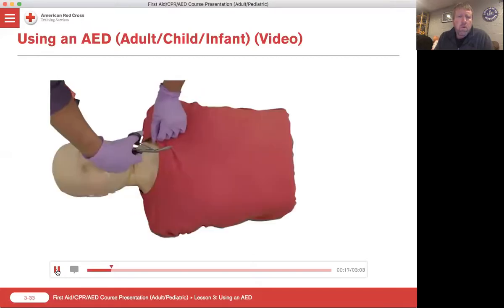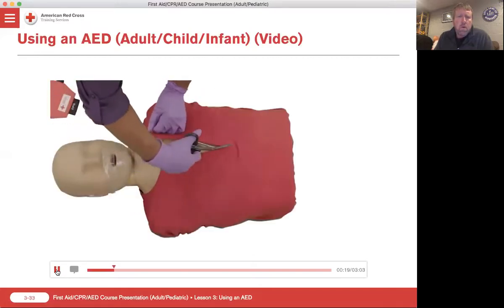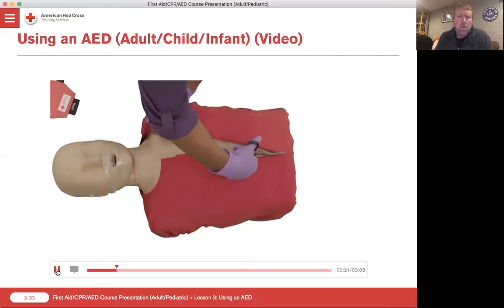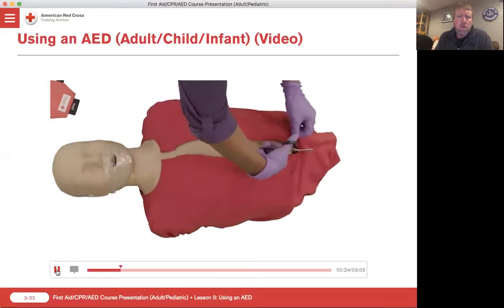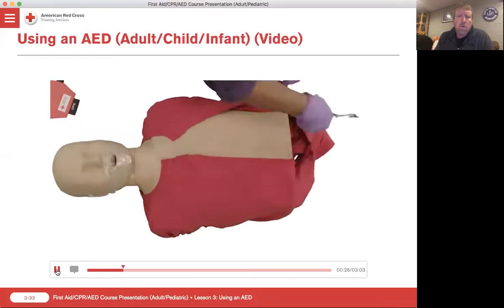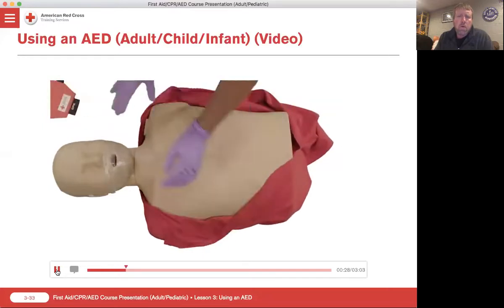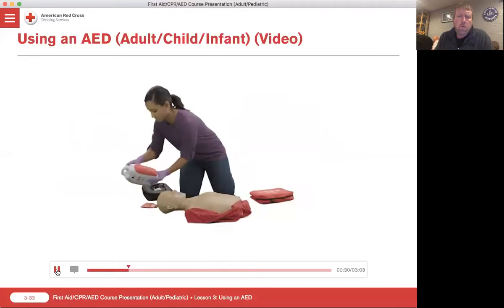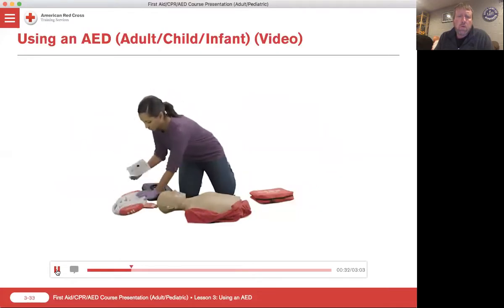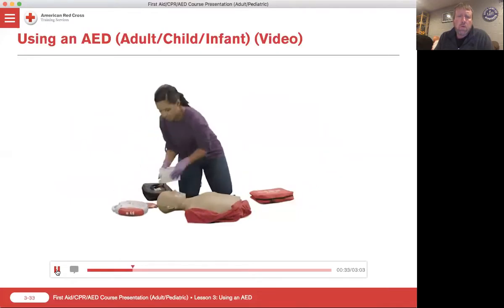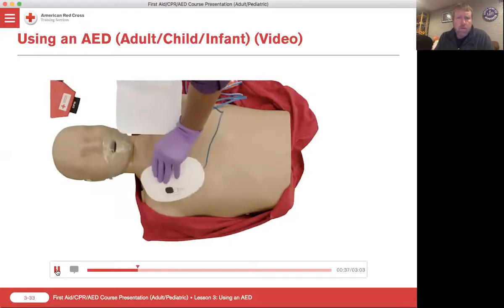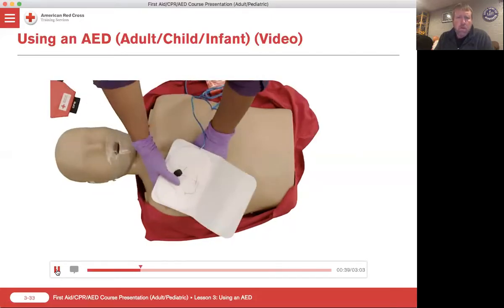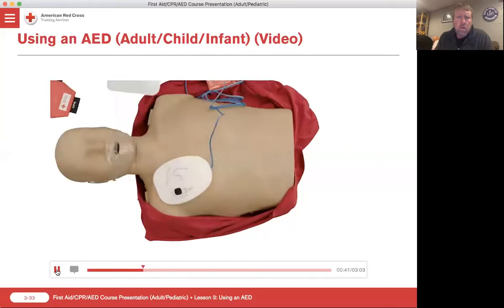Once the AED is turned on, remove all clothing covering the chest and wipe the chest dry if necessary. Using the appropriate sized pads, place one pad on the upper right side of the chest and the other on the lower left side of the chest below the armpit.